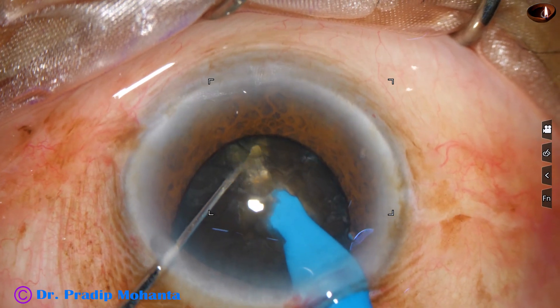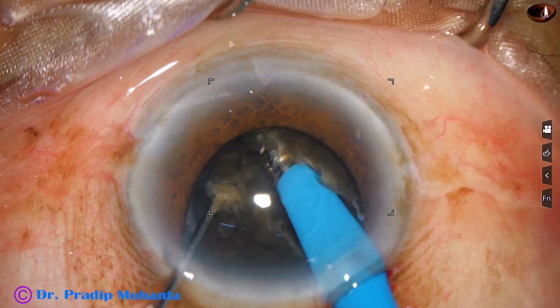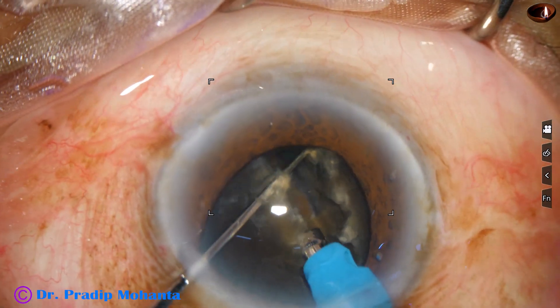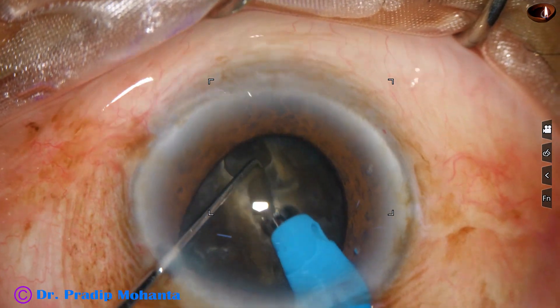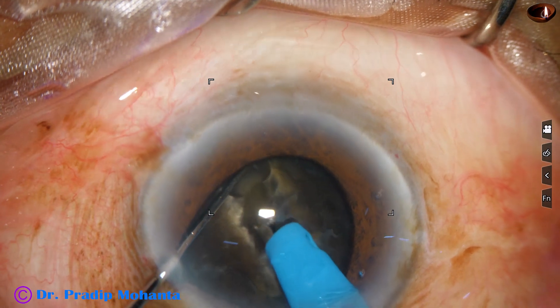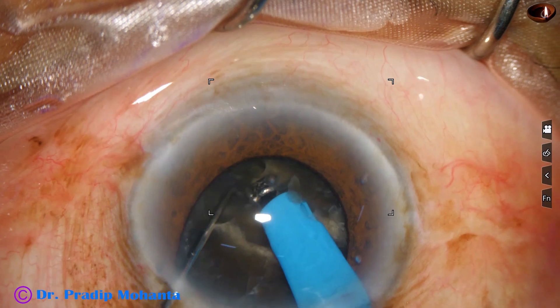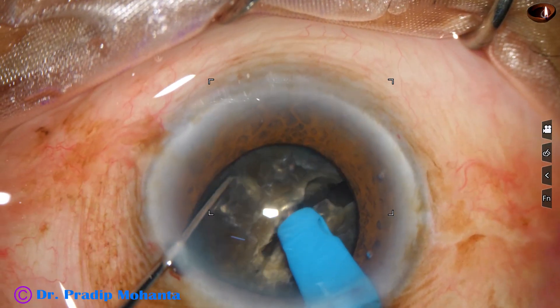As it reaches near the opposite equator, the chopper is used to get a nice crack. The chopper is reintroduced into the depth of the crack, and a good crack is obtained. Not much lateral separation is done. Rotated 180 degrees, a few grooves go to a deeper level, and the two hemi-nuclei are free.